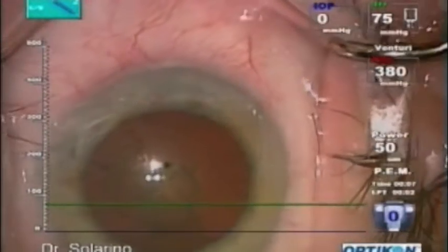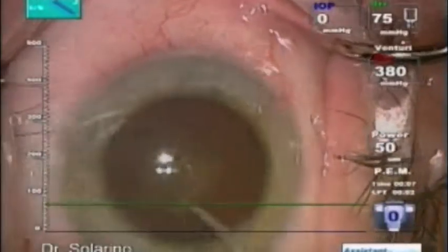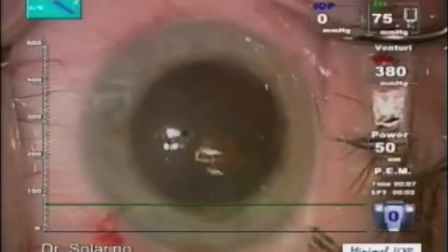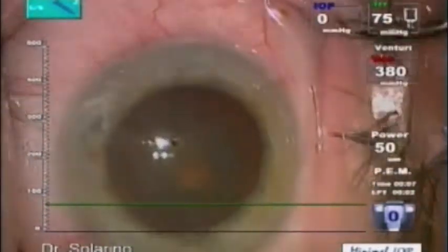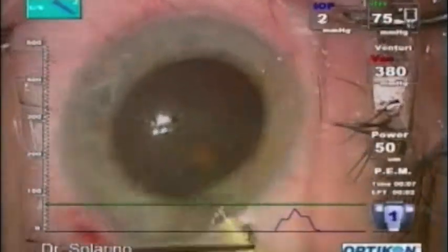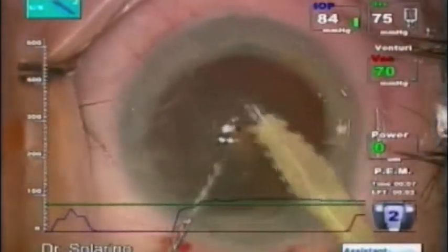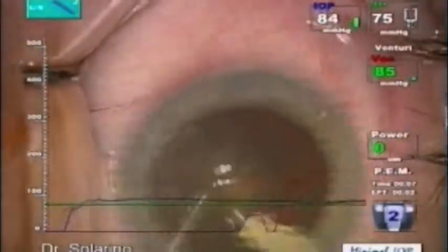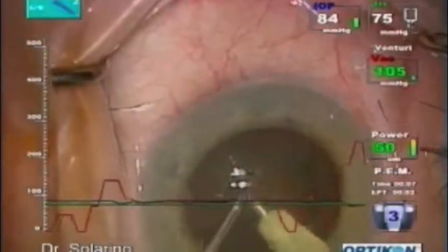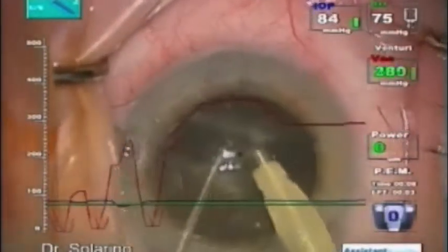Those few seconds more that I spend now will make it more easily — removal of the cortical cataract. Then we'll start directly with the PEM system and a little cleaning of the cortex, and then straight to the center of the nucleus for a good crack, I think.